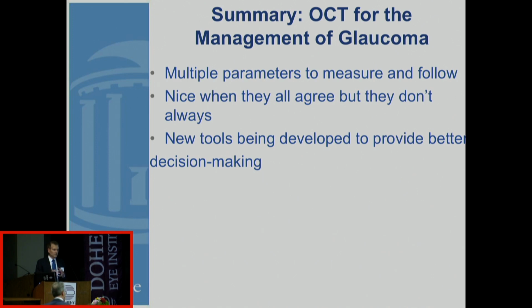What's nice about this model is that the next stage would be to add visual field mean deviation, pattern standard deviation, age of the patient, positive family history, adding additional factors that would increase your clinical suspicion of glaucoma can also be added to a model like this to come up with even more robust probability indices.